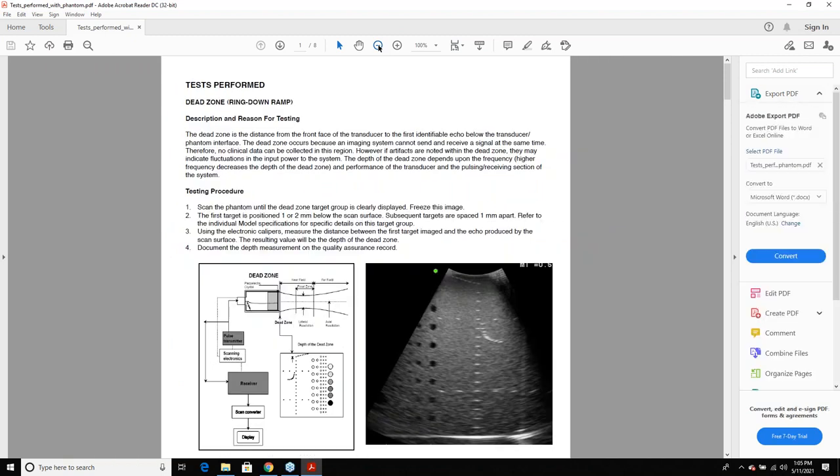I'm not sure you guys can read that. I know it's kind of hard. Again, I can get you a lecture. In fact, if you want, I have it on the thumb drive. If you guys have a device, you want to come up and download it real quick, I have it on the thumb drive. But this is a really cool document.